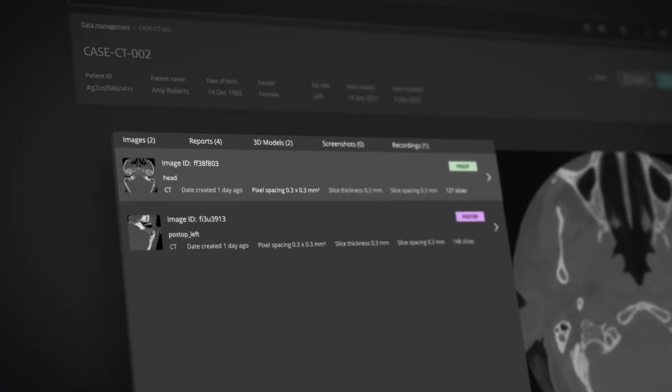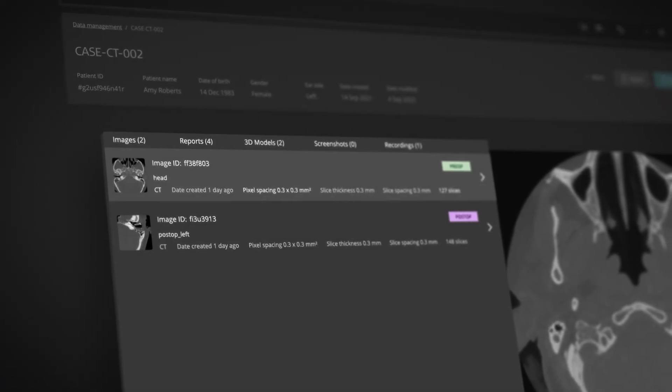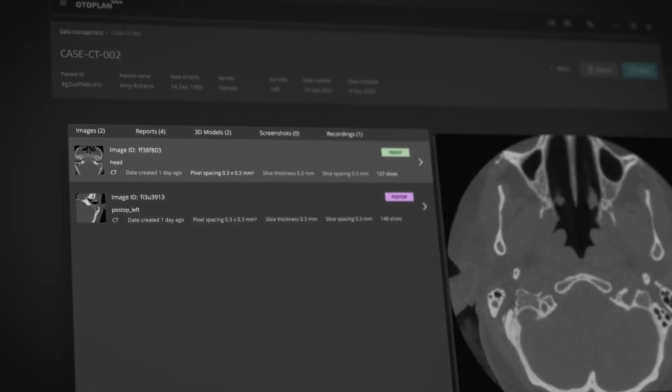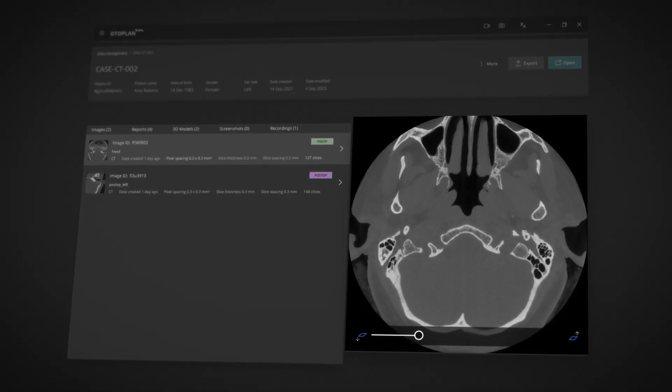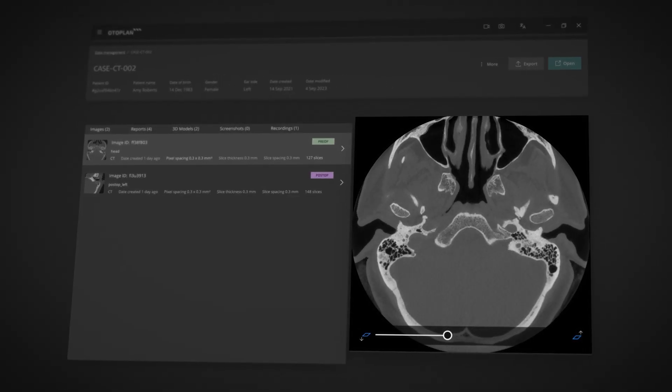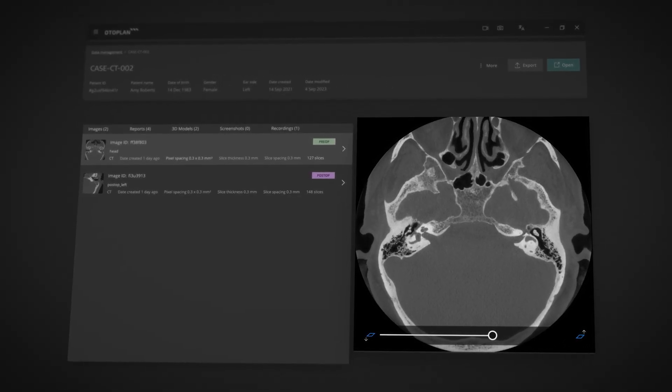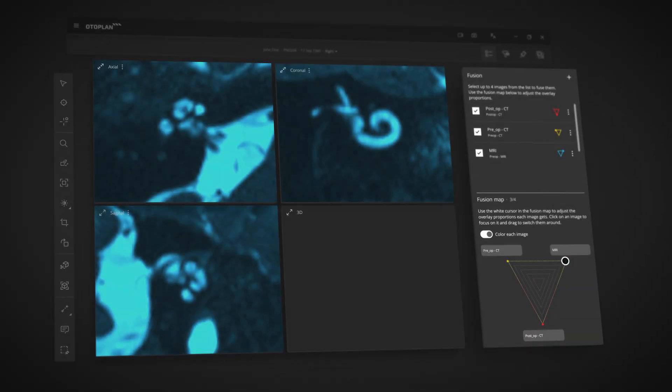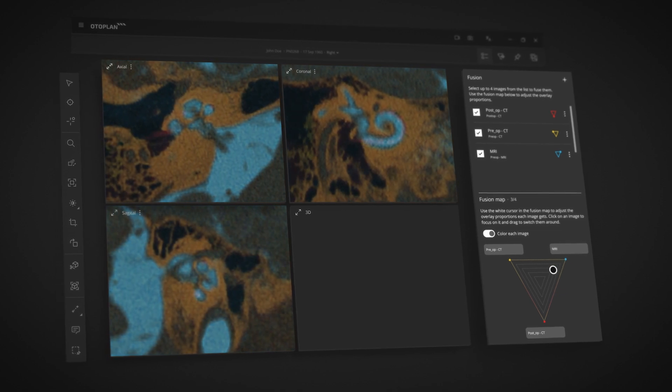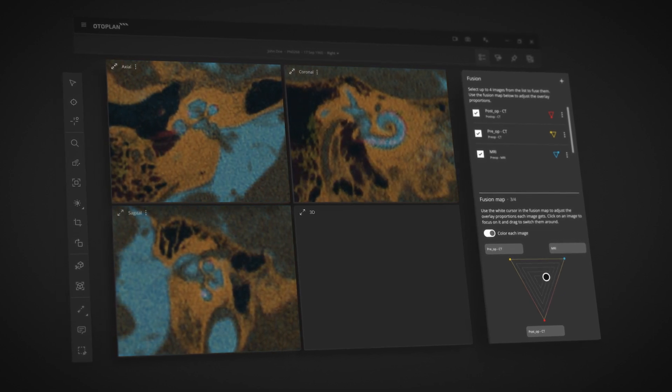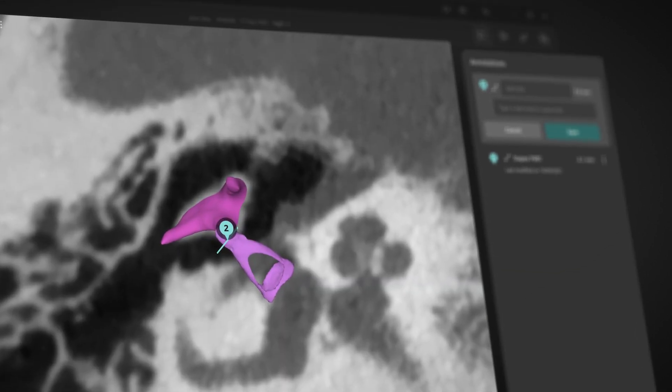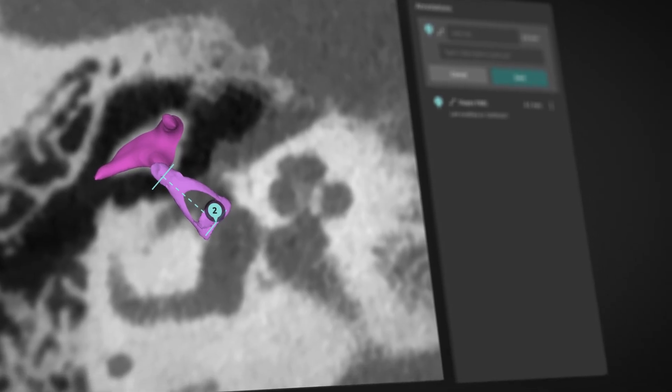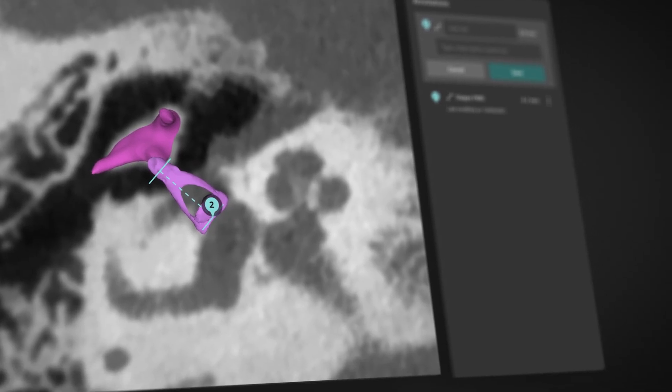Quickly and easily access all the information you need. Seamlessly navigate through patient imaging data. View anatomical structures in detail. Perform measurements on DICOM images using 2D and 3D tools.